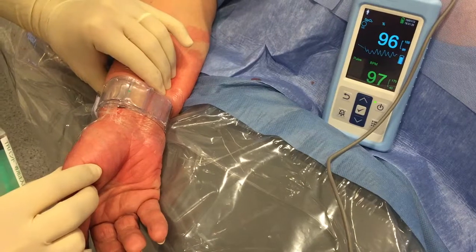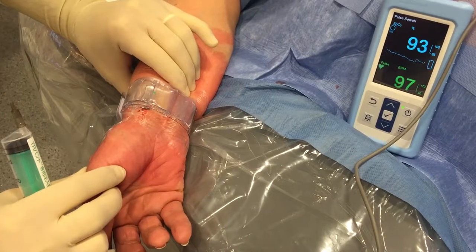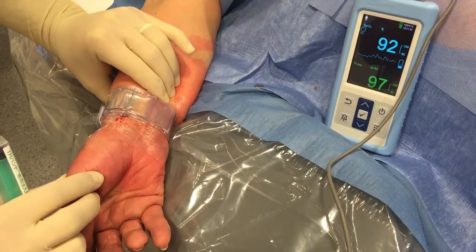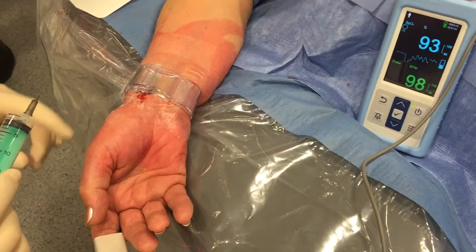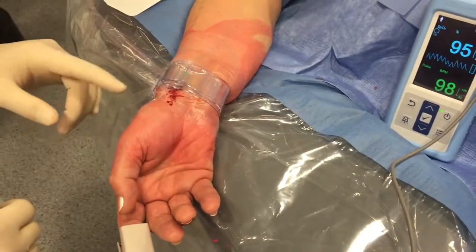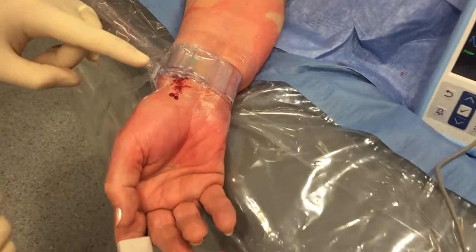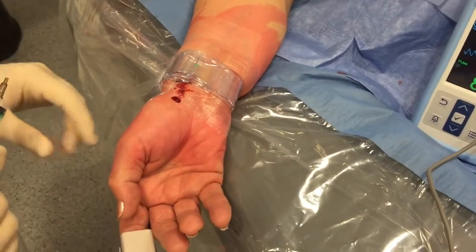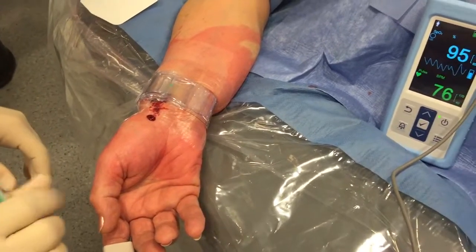You must not have bleeding at the puncture site, which is very important. Here you see that the small curve is reappearing on the plethysmograph, which means the radial artery is now open. In every patient, we try to achieve the lowest pressure possible to keep the artery open without bleeding, so we will try to remove one more cc of air. However, here we have some bleeding, so we need to be careful.